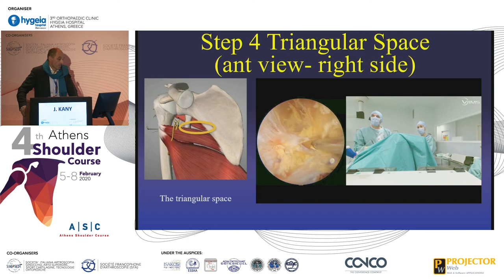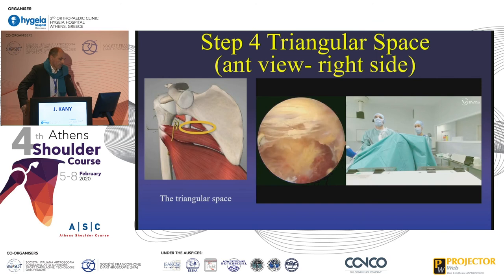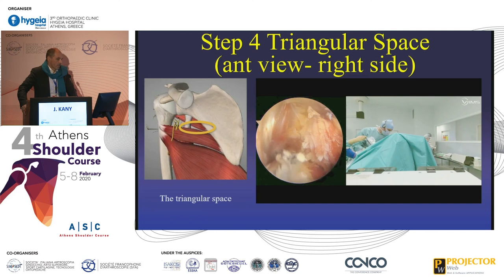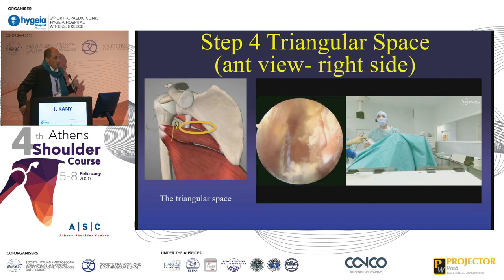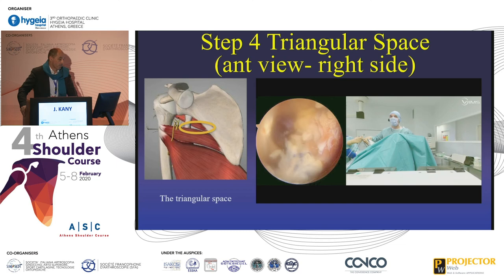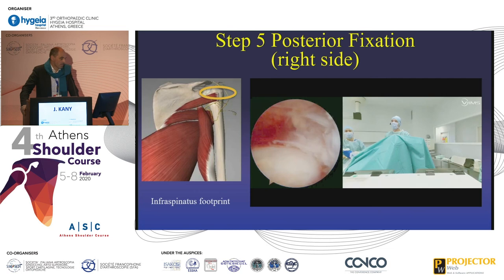If you continue this release, you are able to see the cannula. This is the distal part of the radial nerve, the distal part of the release, because sometimes you have some connections with the long head of the triceps. Now we are into the triangular space. If you continue the release — and this view is very nice — you can see your posterior cannula. That means you are reaching the posterior part of the shoulder. You will see the cannula from the back now coming into the front, and it is large enough to pull back your double transfer.